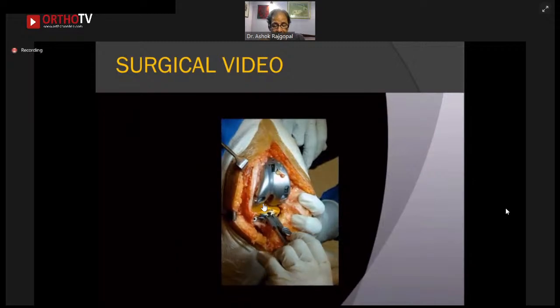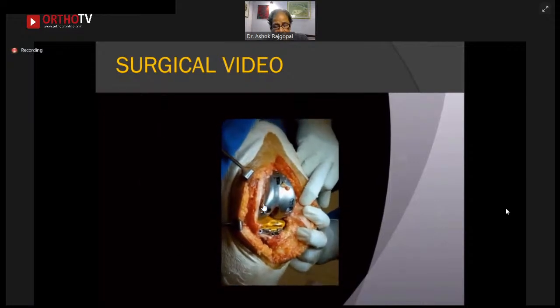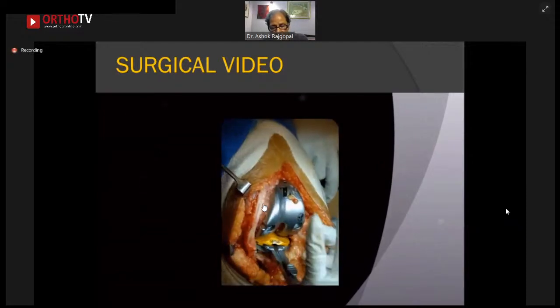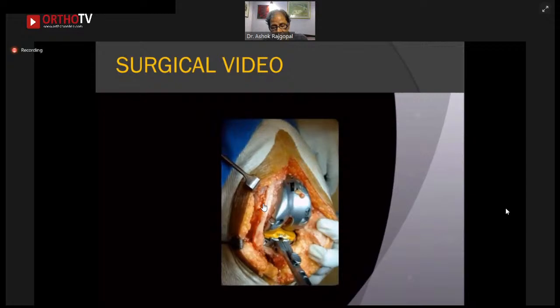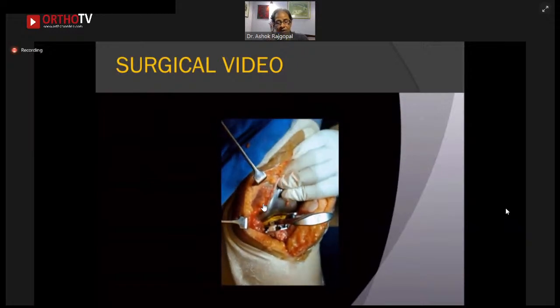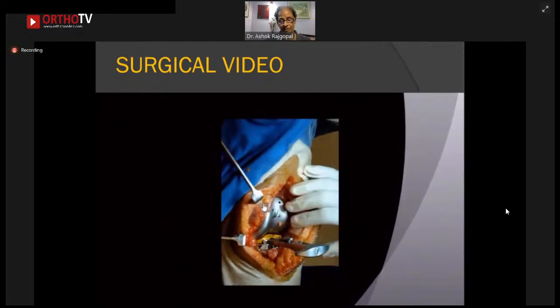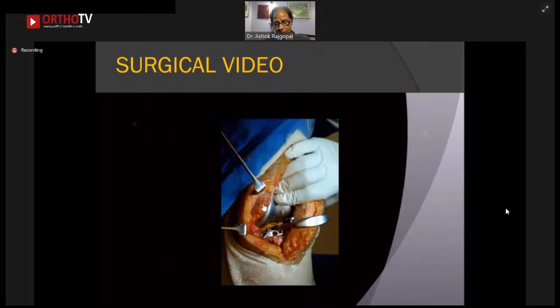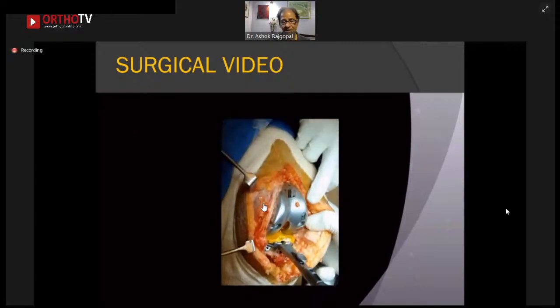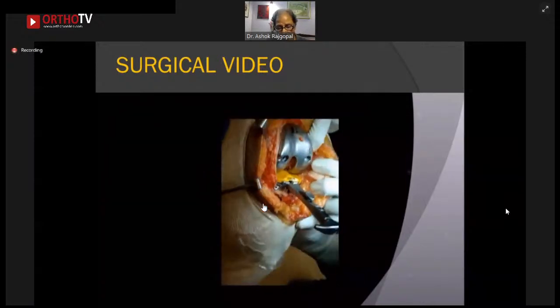One of the features of this system, and I'm sure you have this with other systems as well, is that you can put in these incremental devices. We call these shims, S-H-I-M. So without taking anything, you can go from 10 to 11. They have little markers which tell you it's a 1 millimeter increment. And you just float it in until you think it is stable to your level of stability. Like I mentioned, 1 to 2 millimeters medially, 2 to 3 or 4 on the lateral side. So that's pretty much the way we do our total knee replacements for the varus knee.